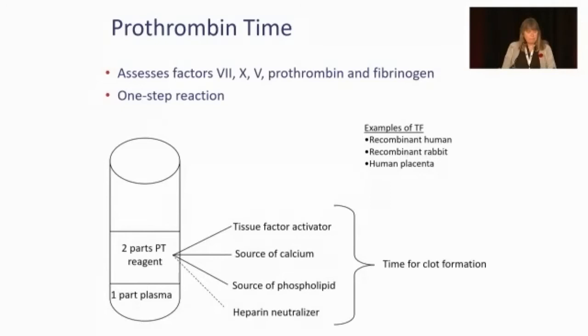In addition, all commercial thromboplastins have a heparin neutralizer. And this heparin neutralizer is still there to this day, even though the use of unfractionated heparin is not as high. And that is because the prothrombin time is used for monitoring warfarin. And because warfarin is a vitamin K antagonist, that takes time to bring down your factors. So you're bridging with a heparin. And so the powers that be many years ago went to the manufacturers and said, we want the heparin effect removed from the prothrombin time. Therefore, we have this heparin neutralizer in the reagents.